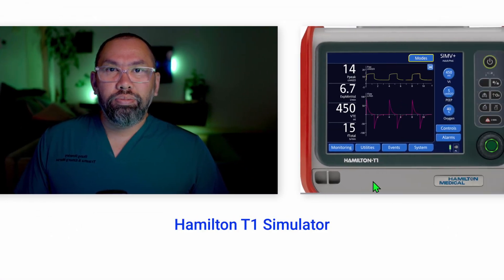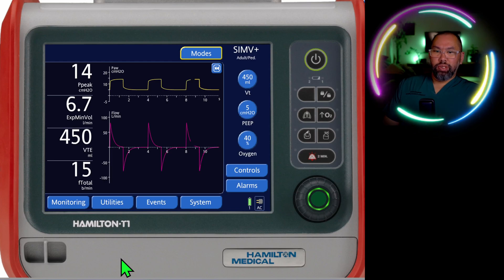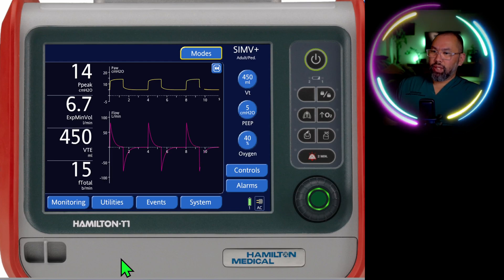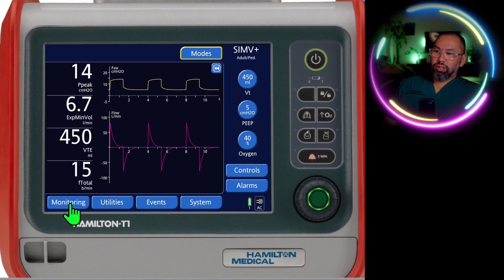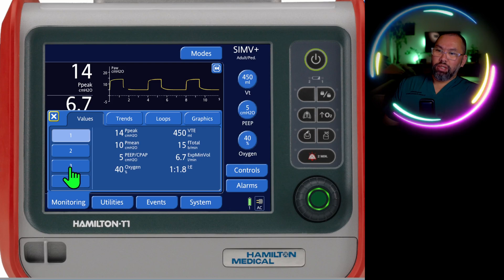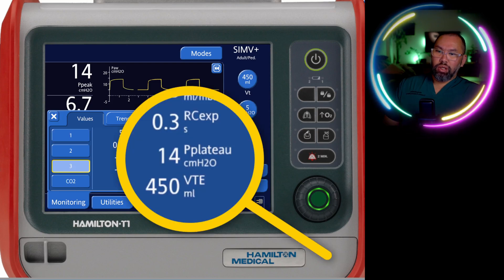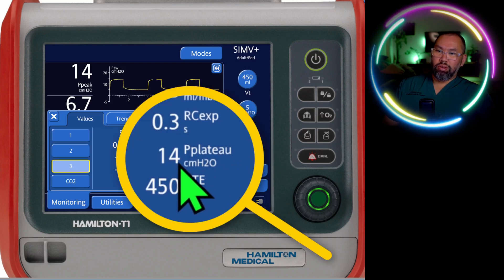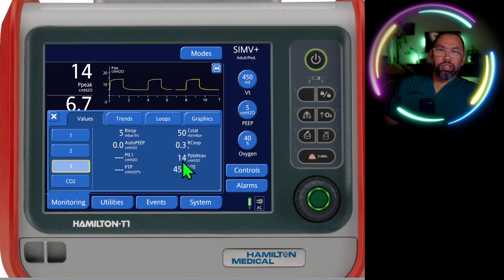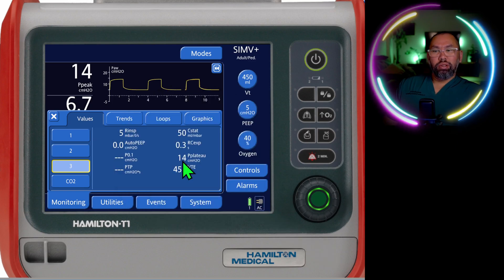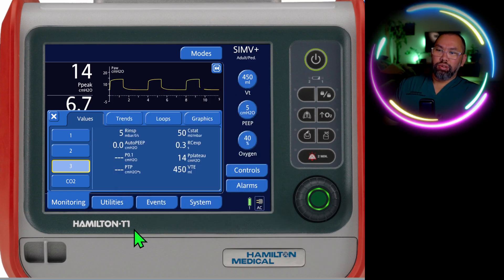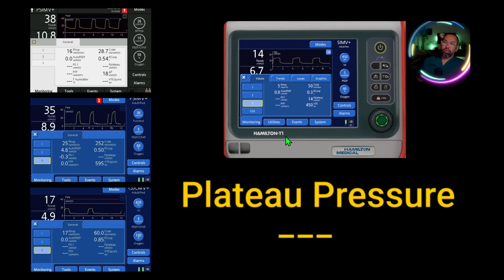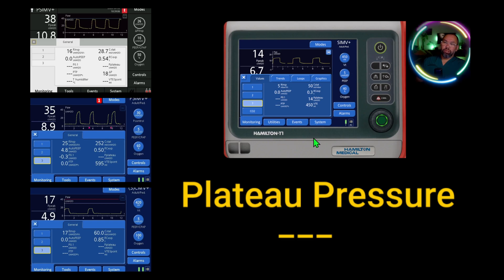Where is this plateau pressure on the T1 and how do we measure it? Here we are ventilating somebody on the T1. To find plateau pressure, just go into your monitoring tab, number 3, and here you'll see plateau pressure, and there's a value. But this is a simulator. In real life if we were to do this, what would we see? A whole lot of this — not very useful.